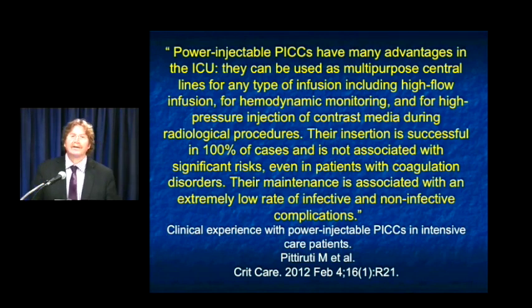I think it's very important that you speak to, if you're in a cancer center, speak to the people in oncology and ask them what lines they're placing. Make sure they're using lines that you can use, because invariably if a patient can have a central line, they're going to get a routine follow-up CT, they may get a PE study, they may get some other vascular study. Having the right central lines becomes very important. So when you think about it, when we talk about CT, there's so much beyond the actual reading of the scan that becomes very, very important for us to do.